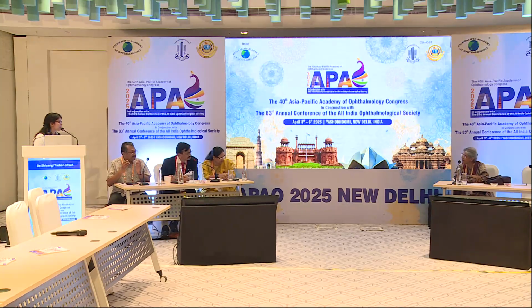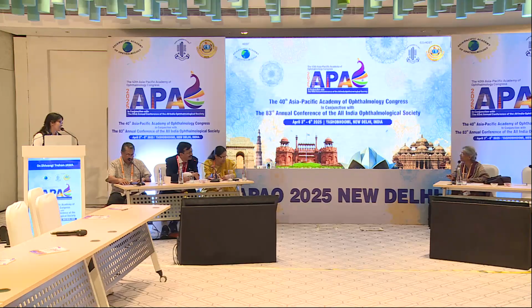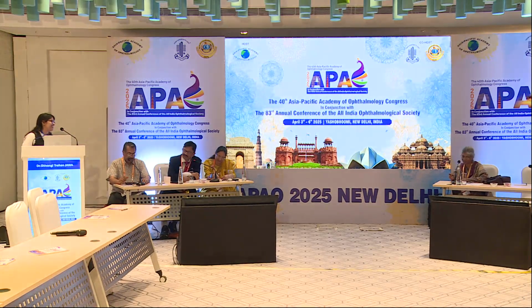Macular edema can be seen by slit lamp biomicroscopy also. Maybe that was a thesis topic that was allotted to you? Yes, ma'am. But OCT can tell you the exact thickness, ma'am. If you are seeing with the 90D, it will not give you exactly how much. A significant macular edema you can notice, but hardly a few microns we cannot pick up by naked eye. Basically, all these residents are going for the OCT rather than for the clinical evaluation. Just wanted to emphasize on that point. Okay, thank you.